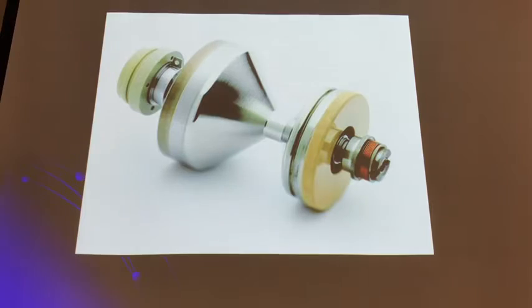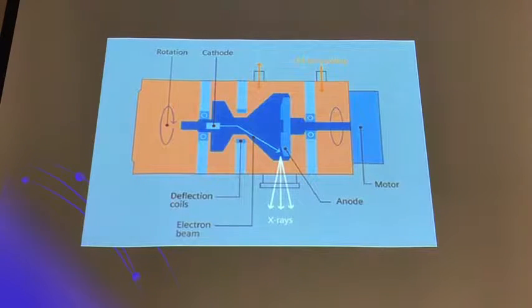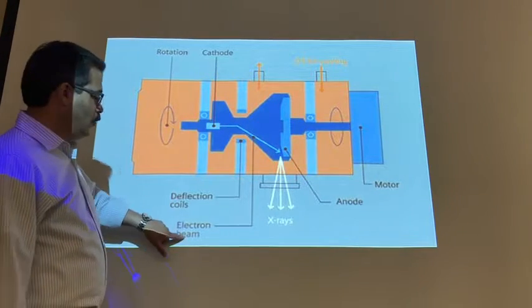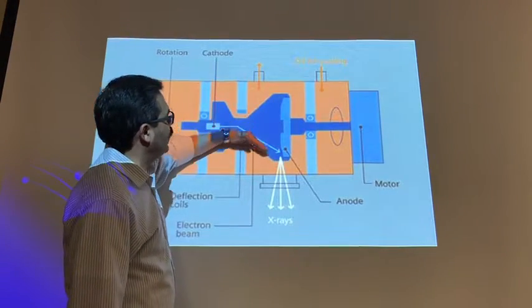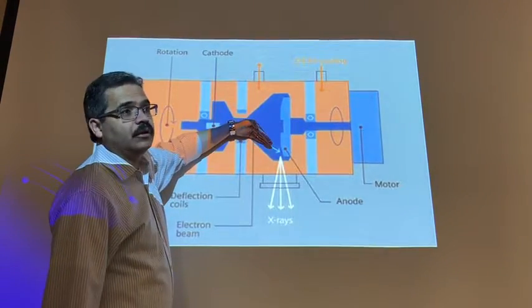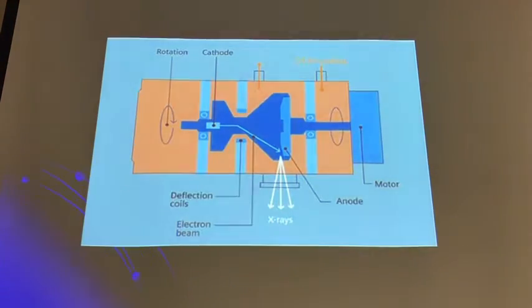Is that in a vacuum? It's still a vacuum. All right, and so here's the idea. Take a look. The cathode, and the anode is all the way here, but you have these deflection coils throughout here, and they direct where these electrons are going. Would that be isotropic as well? It's still isotropic, yeah.